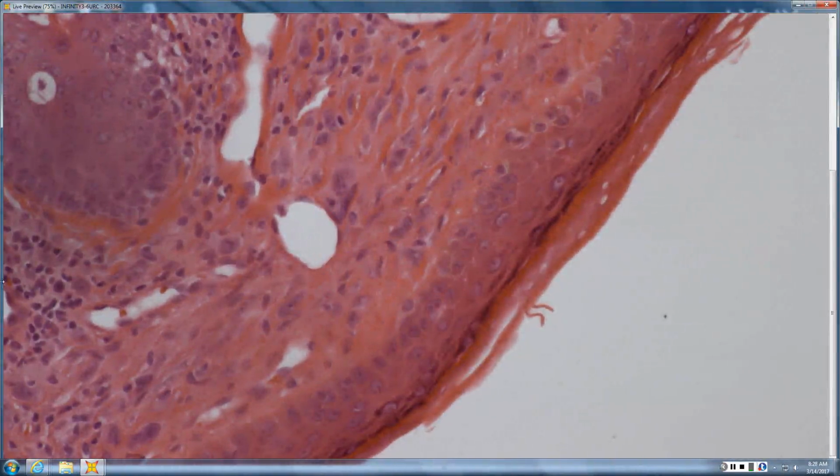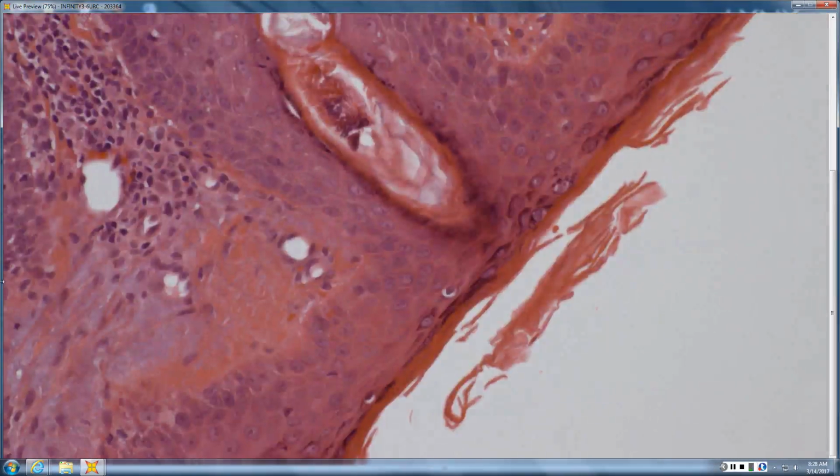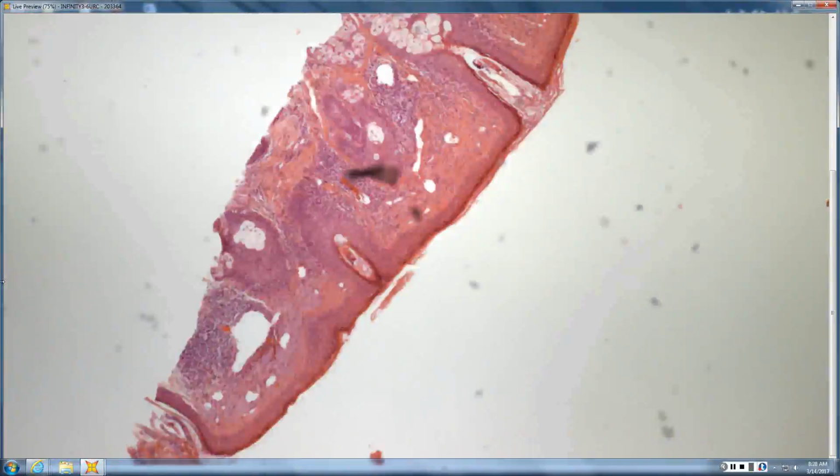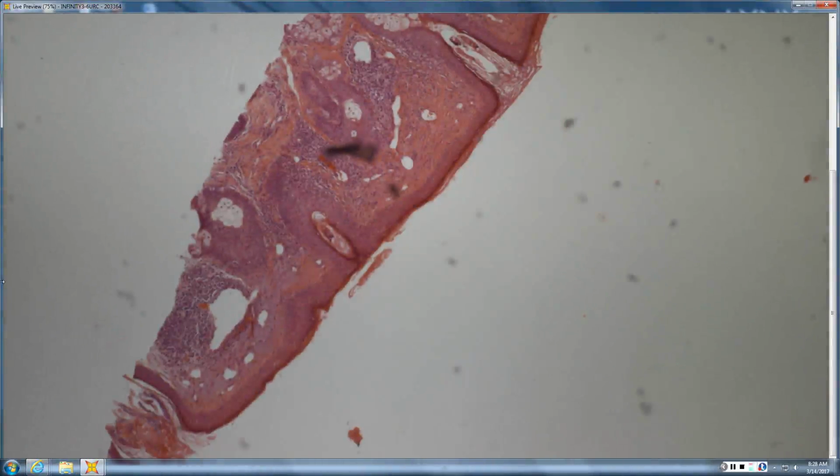They don't quite look like stellate fibroblasts. They're not so stellate, they're more epithelioid, right? But it's superficial with ectatic vessels on facial skin. That's okay for a fibrous papule. More characteristically, they're stellate, sometimes they're epithelioid. It's okay. And I think we're out of time.